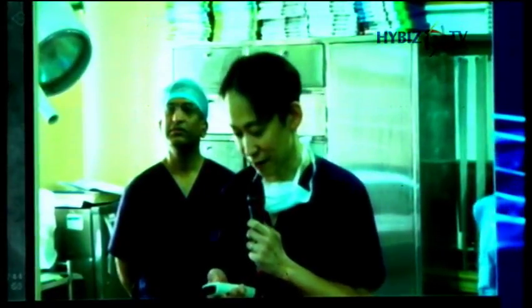This is, you can see, the knuckle wire. How did you advance your antegrade wire? Was it IVUS guided? No. For the antegrade wire, we can use the retrograde knuckle wire as a landmark. Finally, the Miracle 12 gram advances to the distal RCA, and the Miracle 12 gram has a good support, so I can dilate the distal side and then check the IVUS.